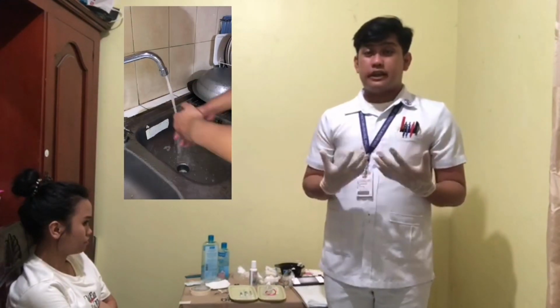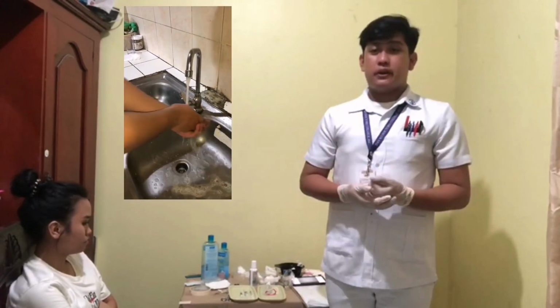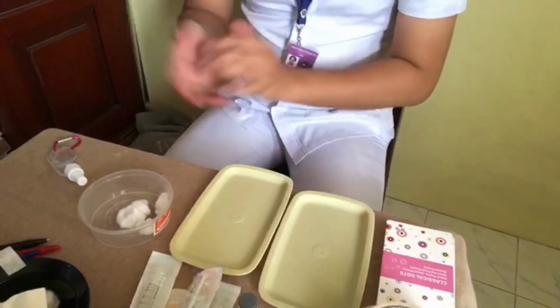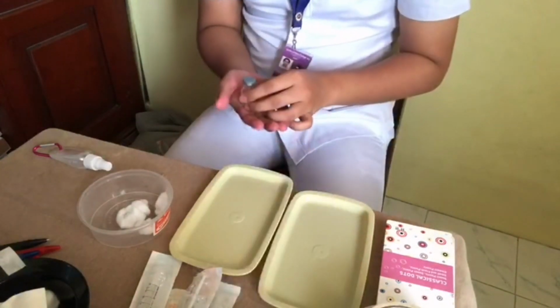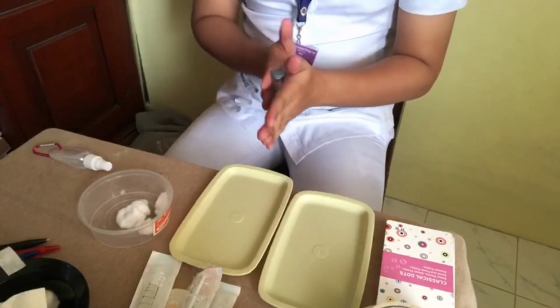First, we make sure that we have performed hand hygiene and observed appropriate infection prevention. Since I have already performed hand hygiene and sanitation to prevent cross-contamination, we'll now start by preparing the drug for withdrawal. We have to mix the solution by rotating the vial between the palms of the hands, making sure not to shake it. Just rotate it.